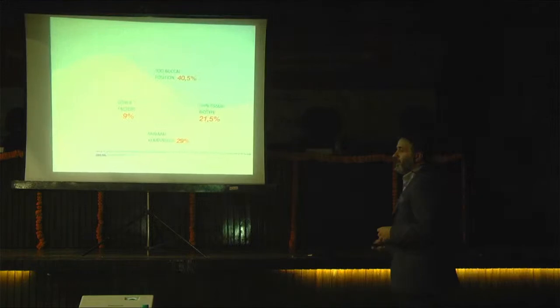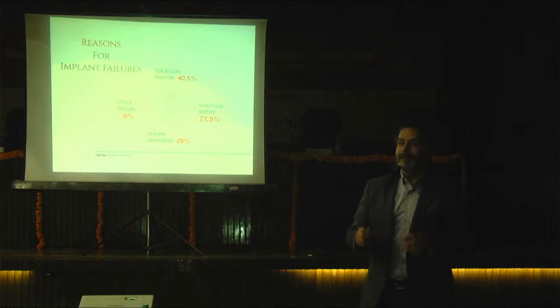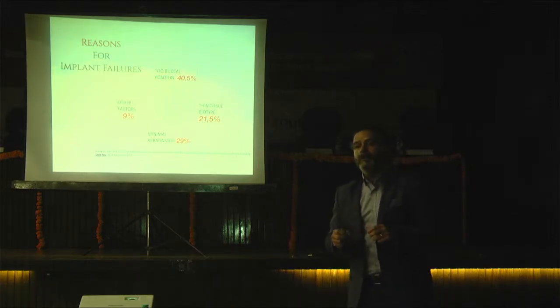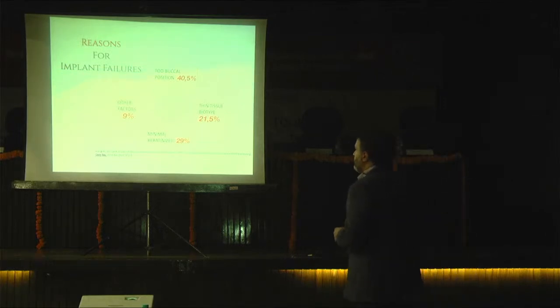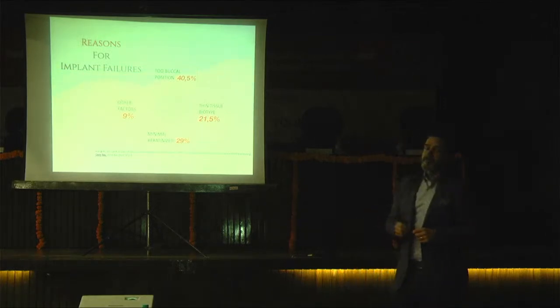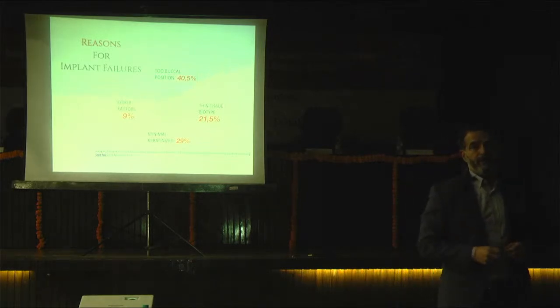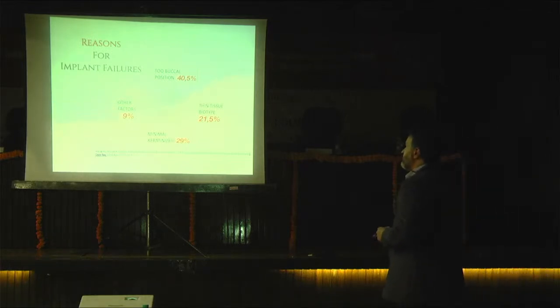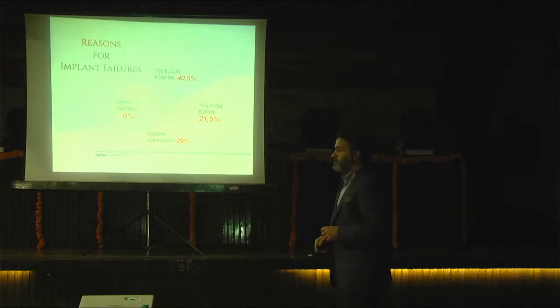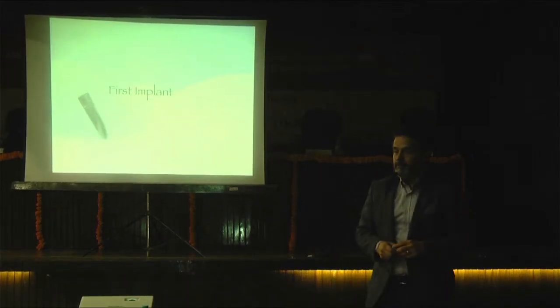So, what I'm trying to tell, let's start with the reasons of implant failures. We place the implants very buccally. When we classify the reasons, it is clearly seen that placing the implants very buccally accounts for around 40.5%. That means we don't know the best place to put them.